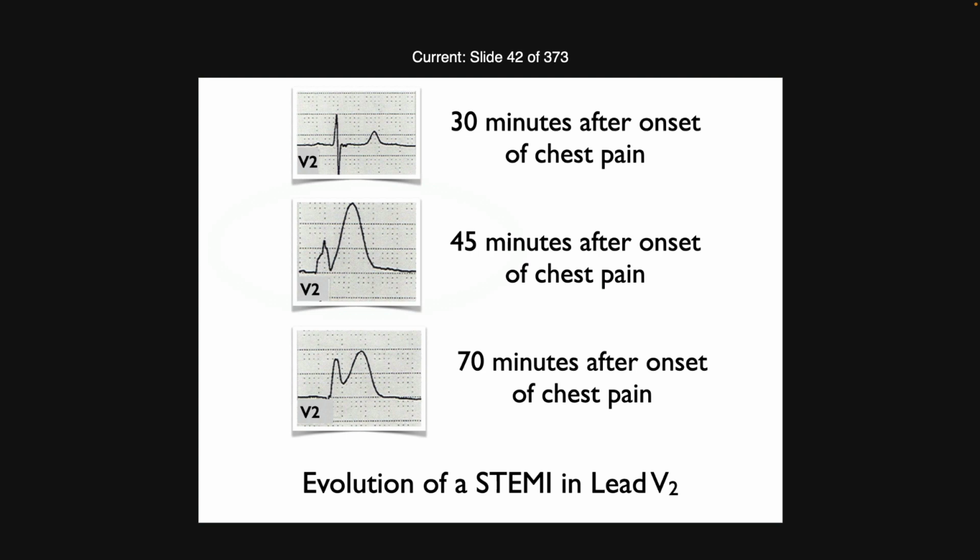Is that with just the 4 lead or the full 12? Once you have the 12 lead on, when the rhythm changes or you see drastic changes like ST elevation, it'll just automatically print it out.